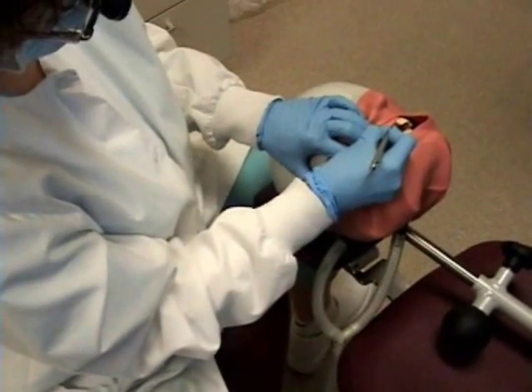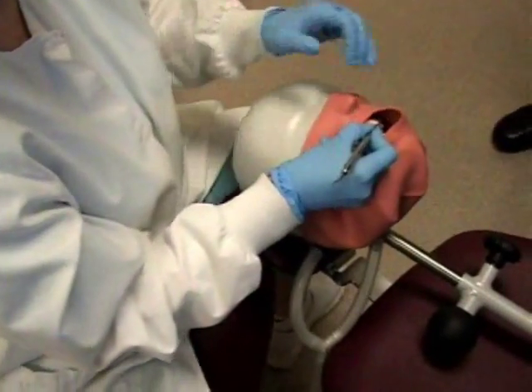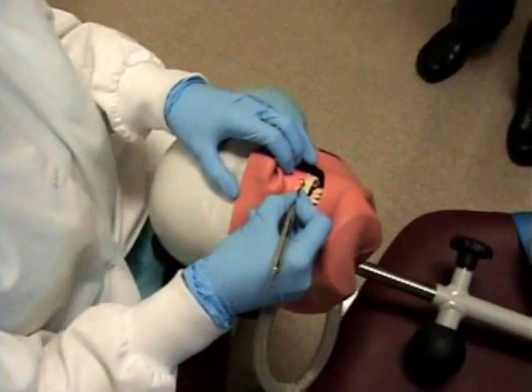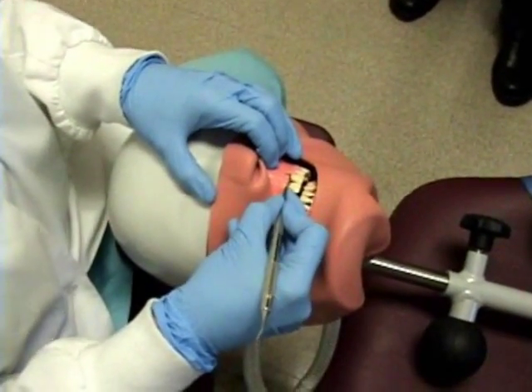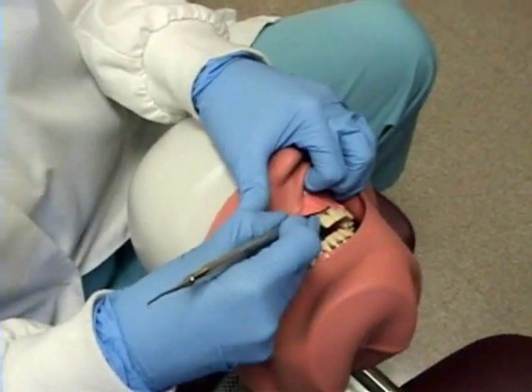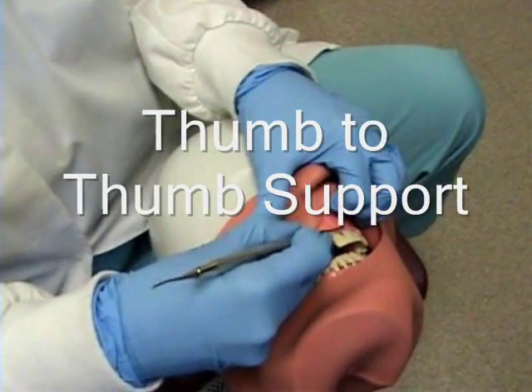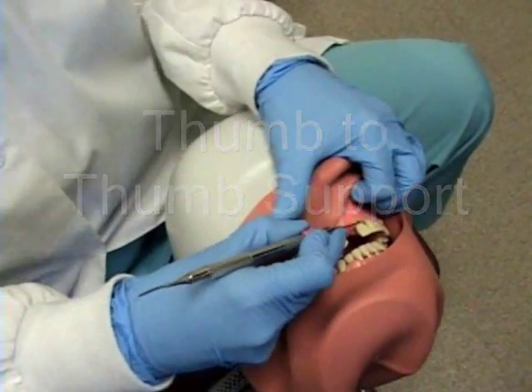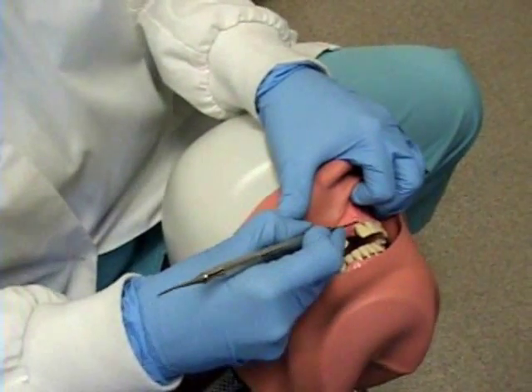Nice wrist motion, removing that deposit that's often difficult to remove on the very narrow root surface. In this advanced technique, Ms. Johnson is using her thumb to stabilize the thumb of her instrument hand and also provide additional lateral pressure and support.